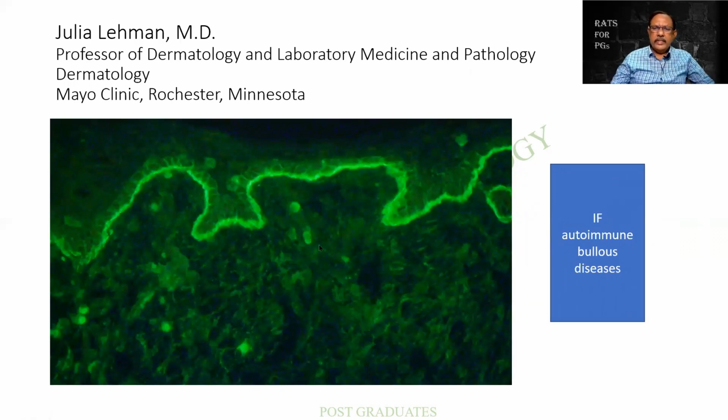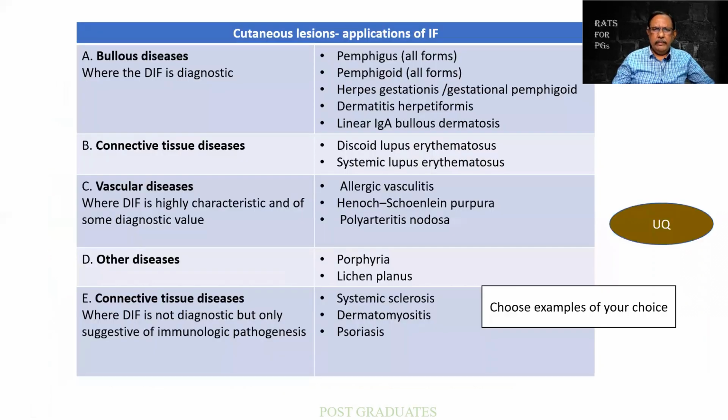The next series will be dermatology. Dermatology, you find that it is a nightmare for us. Making diagnosis of vesiculobullous diseases without immunofluorescence is a real nightmare. And thanks to this picture, it is from a particular source that I had mentioned over here. It can be used for many an autoimmune disease. I would like you people to kindly go through the entire list that I am projecting and learn it by heart.